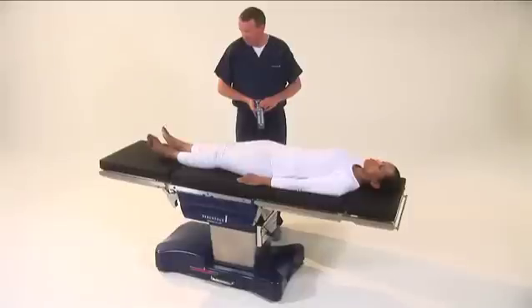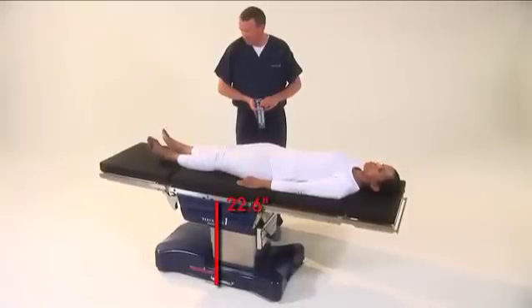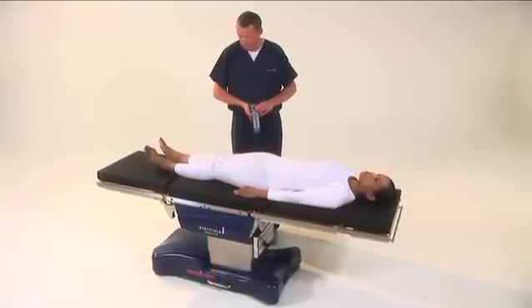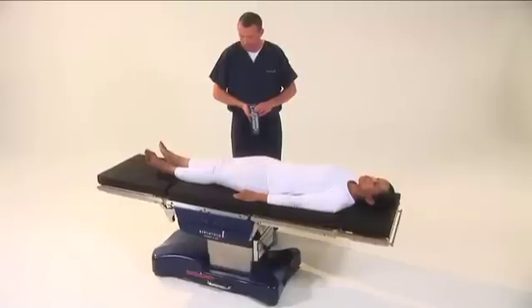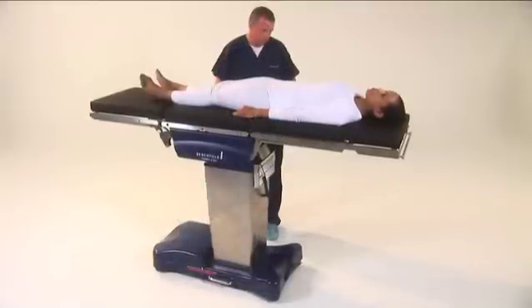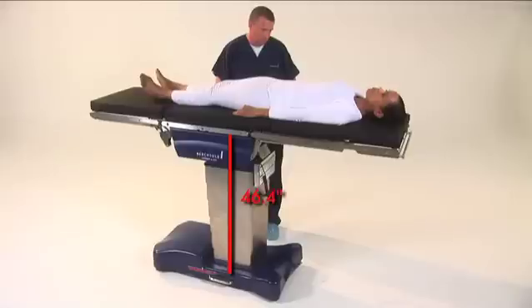The D850 can be lowered to 22.6 inches, measured from the floor. To lower the table, press and hold the table down button until the desired height has been achieved. The table can also be raised to 46.4 inches.